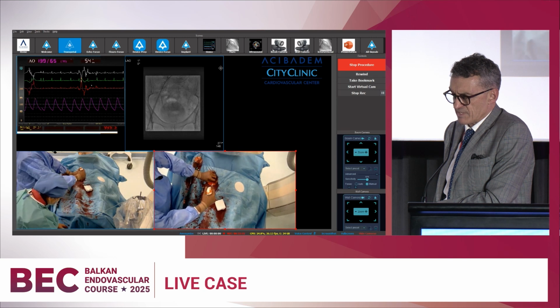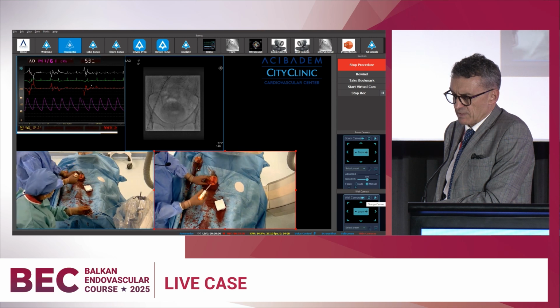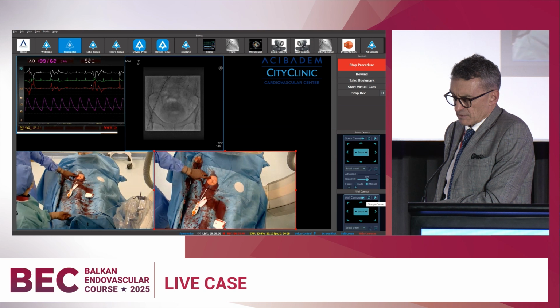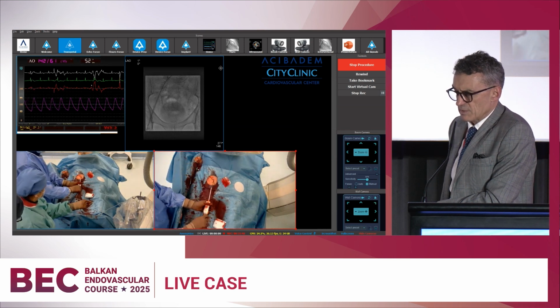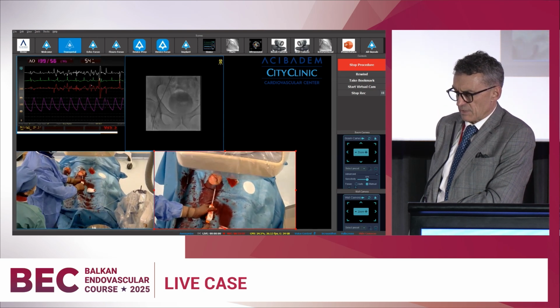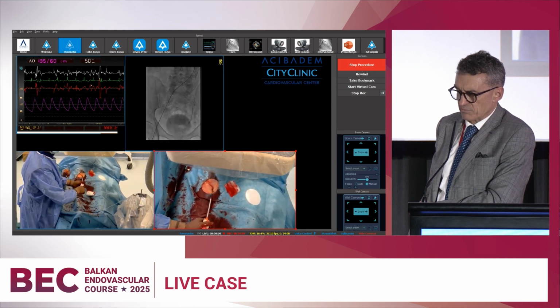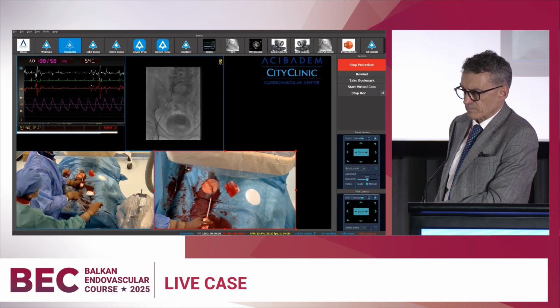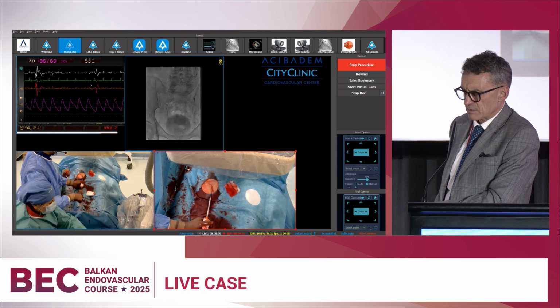So this is the Manta, the several steps of Manta closure. There is a first click, the red window. Yes, looks very good. You see? Successful. You see there is zero. I think they removed the wire. Yeah, you have to remove the wire, cut the suture, and make a final iliac injection. You see there is almost practically immediate local hemostasis. It's enough, not anymore necessary to maintain some access.